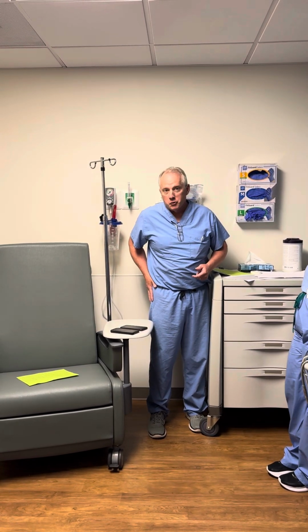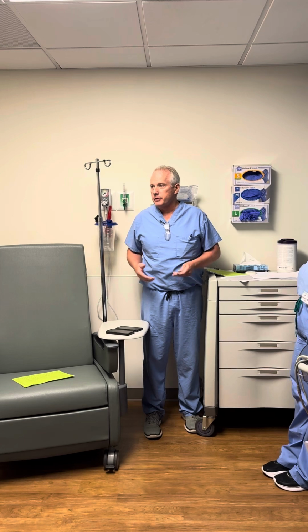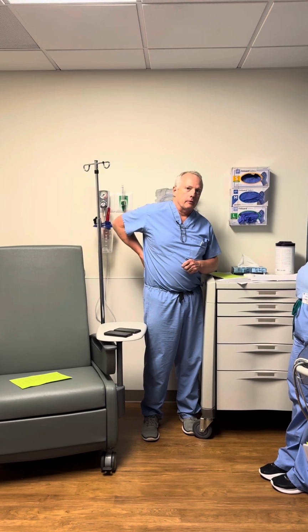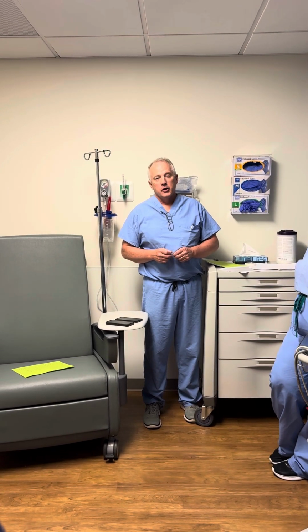Now, if they have a total joint, right? You come in with the bionic patient, right? They've got new knees, new hips, and maybe a shoulder and elbow or something. Then you just try to find an area that's on the same side, that flank. I would try and go flank. Yeah. We've had them. They got hardware in their back, they got their hips. It's like, where do you put it? Right. Back of your head. Just put it on their cheek.